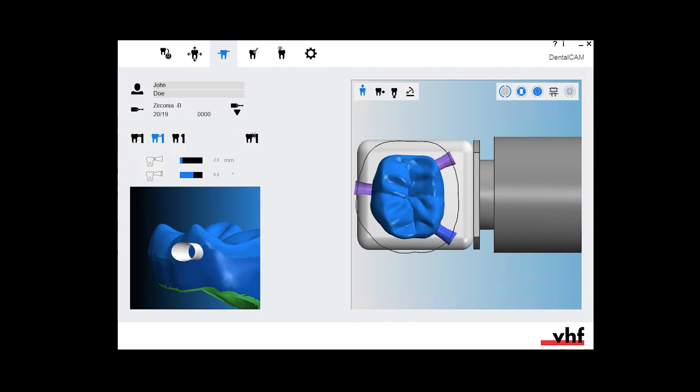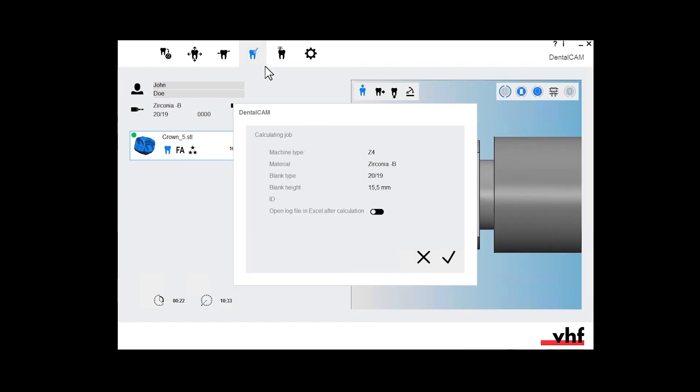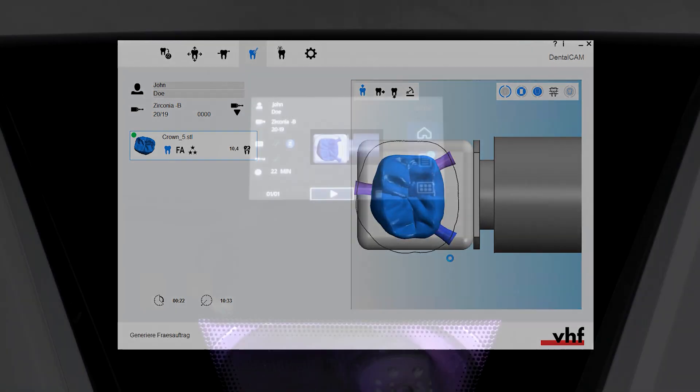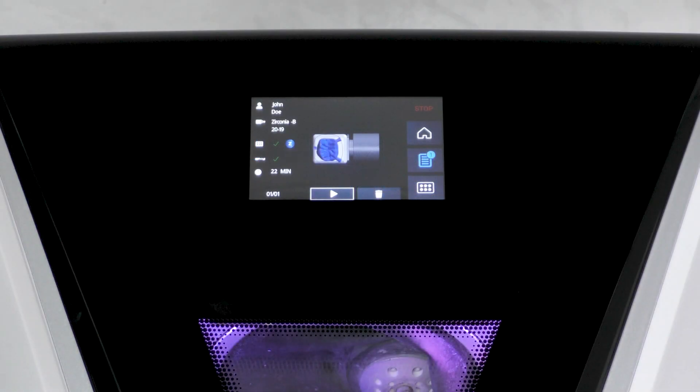After you have successfully nested your object, start the job calculation. Confirm the message. Your job will display on the touch screen.